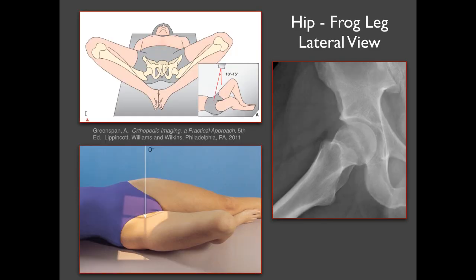In addition to the AP view, you can get a frog leg lateral view. You can see why it's called that — this person looks like a frog laying down. The pelvis may be rotated a little bit, but the key thing is that the legs are splayed out like a frog. That gives a different rotation, a different projection of the femoral head and neck.